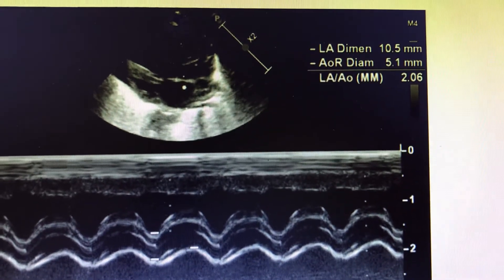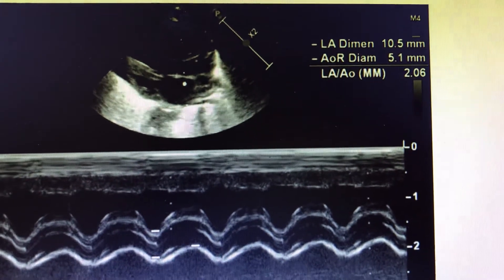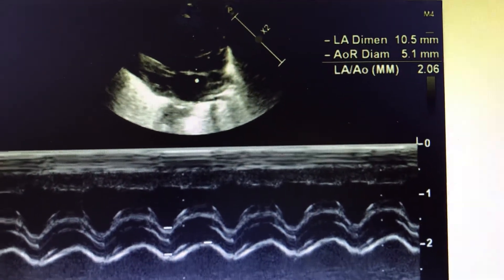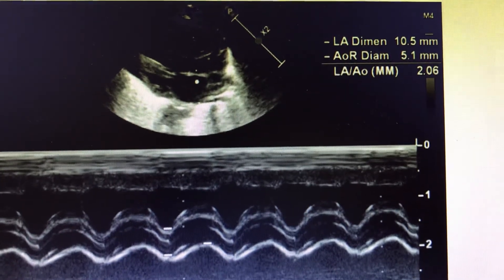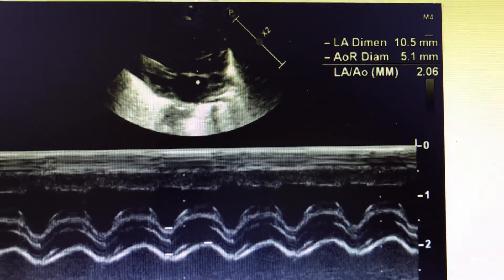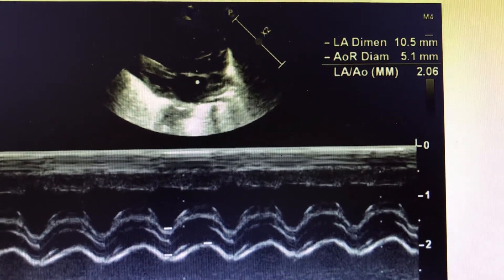We will further discuss the severity and the dimensions indicating a very large, non-restrictive PDA with significant blood flow.